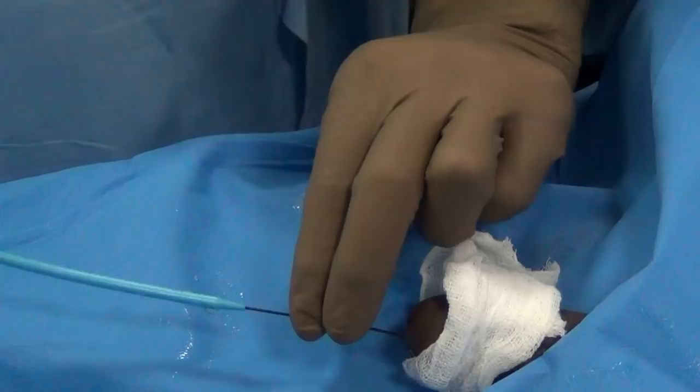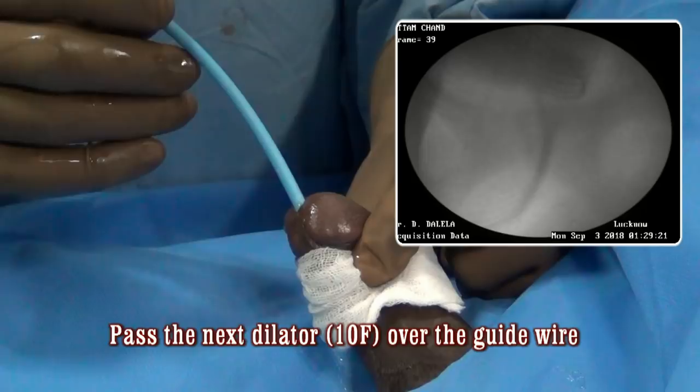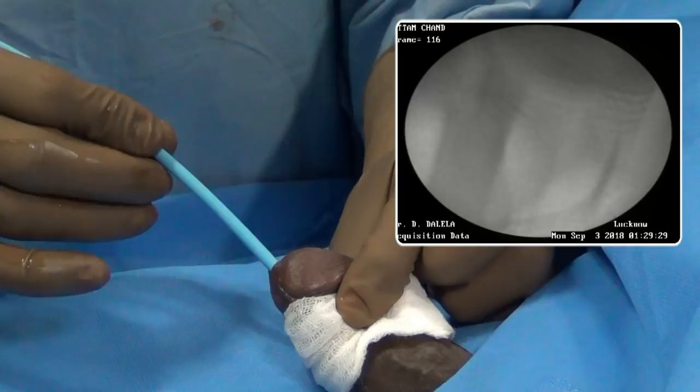Next, pass a 10 French dilator over the guide wire following the same technique. Watch the entry into the urinary bladder. Be very gentle while dilating the stricture — do not use any force. Withdraw the dilator gently and then watch for any blood at the meatus or at the dilator tip.